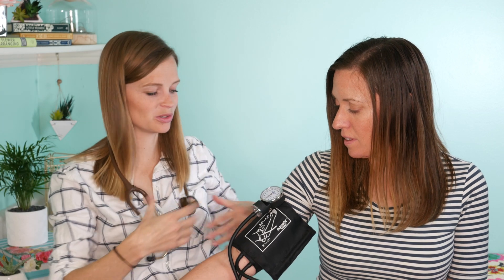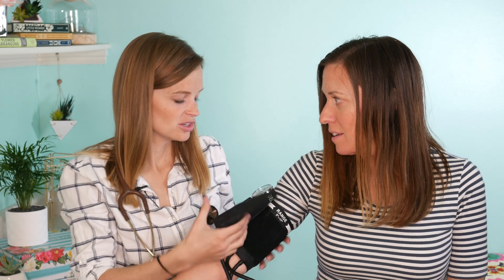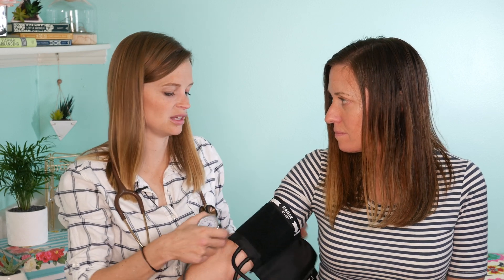That's a really good blood pressure. Textbook normal is 120 over 80. A lower blood pressure is not necessarily a bad thing unless the person is getting dizzy when they stand up or feeling like they're going to faint — then that's something to be concerned about. Lower is usually better to a point; you don't want it to be way too low or they might pass out.